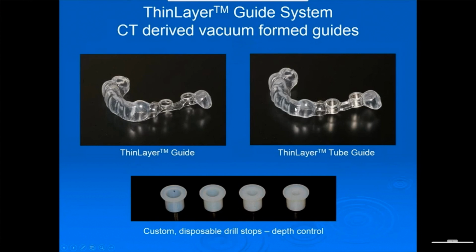Our guides, which we call the ThinLayer guide system, include a ThinLayer guide, which is a tubeless guide, plus a ThinLayer tube guide, which functions like a conventional tube guide, in addition to custom disposable drill stops for depth control. This is what we provide for every guided surgery case.